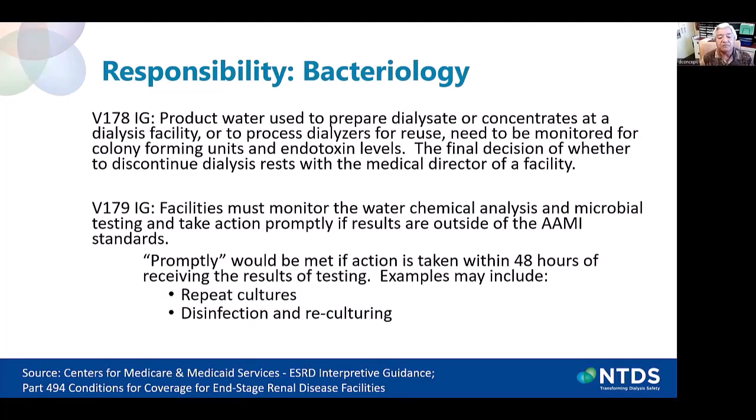Product water used to prepare dialysate or concentrate at the dialysis facility, or to process dialyzers for reuse, needs to be monitored for colony-forming units and endotoxin levels. Regulations do not specify what to do when the levels exceed the allowable limits. Because of the risk of adverse events, such as pyrogenic reactions, the results of colony-forming units and endotoxin levels must be balanced against the risk of uremia if a patient is not dialyzed.